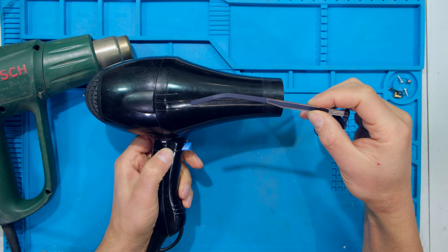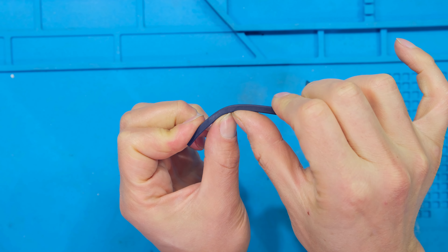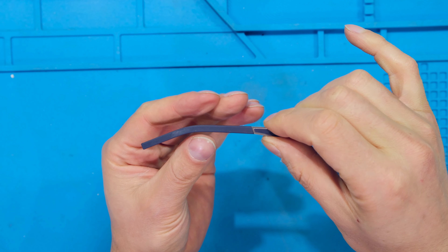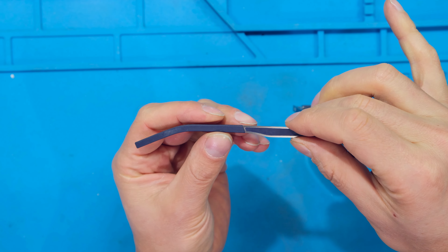You can also use a hairdryer — it is more time-consuming but it also works. In this case I need to bend this temple down and also a bit inwards, but notice that when I'm doing it it just flicks right back, so that's why it needs to be heated up. One of the challenges is if you heat it up too much it'll just bubble and it will be destroyed.